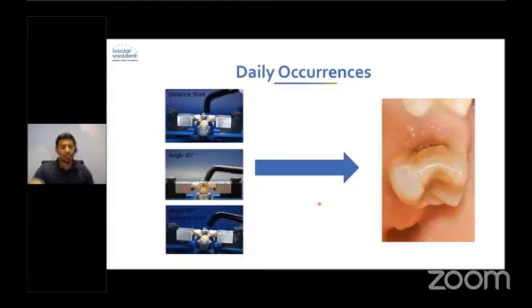Because what you can find is that sometimes the light probe could be about 5 millimeters away, or it's actually angled away, or angled and completely away, and you'll find some areas that weren't completely fully cured, and that can lead to secondary caries, and that's an issue here. And yeah, sure, we could be talking about the upper left 7 or a 2-7 DO, and you can't get the light probe stuck right behind the patient's 7, right? But you need to be able to find enough intensity that it's also able to cure that deep. But I will explain to you in a minute there.